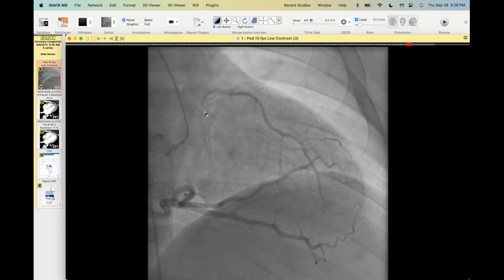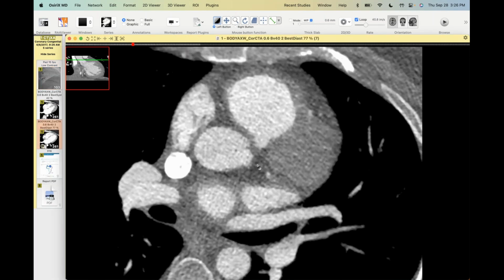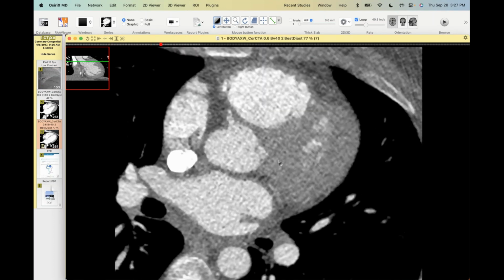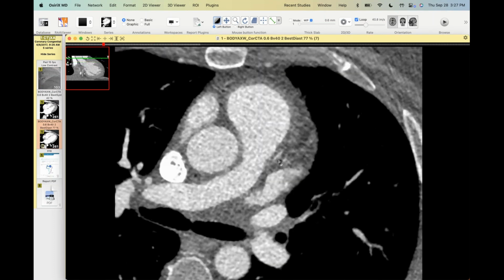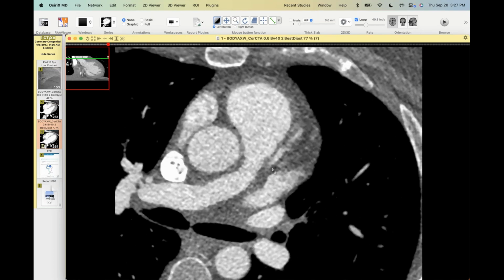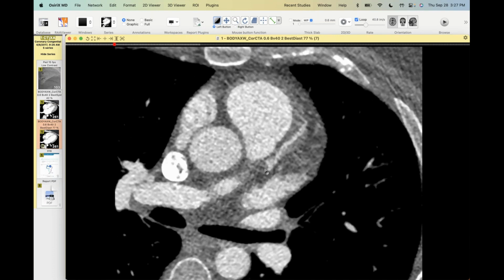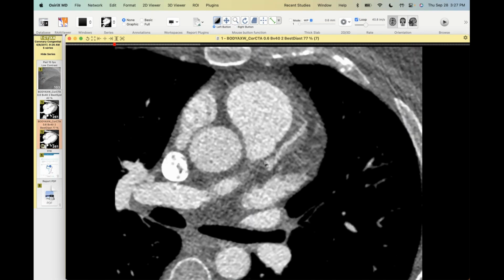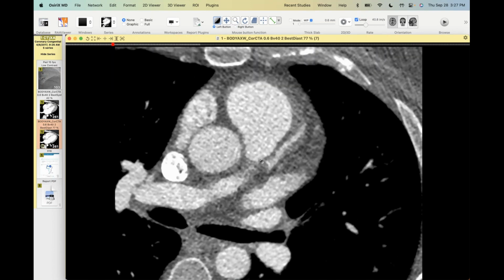And this one I can believe more why the patient didn't present until adulthood, in the sense that you can see the left coronary artery. It's not as big because you don't actually have a huge fistula here. And that's because at surgery, when they found the ostium of the left main coronary artery on the pulmonary artery, it was less than a millimeter. They could see it, but they couldn't really cannulate it with a probe. So in this case, they ligated this and then did a bypass to the left-sided system.